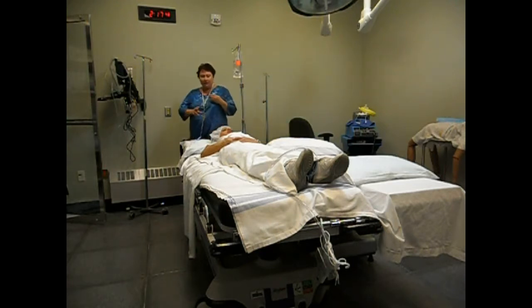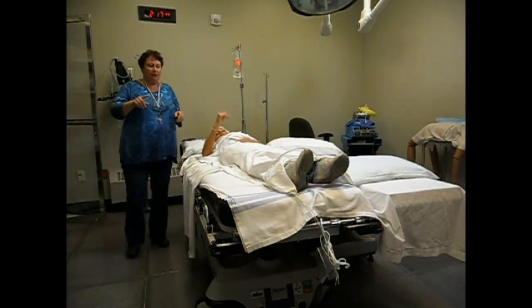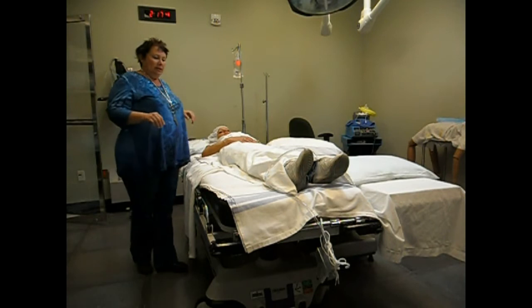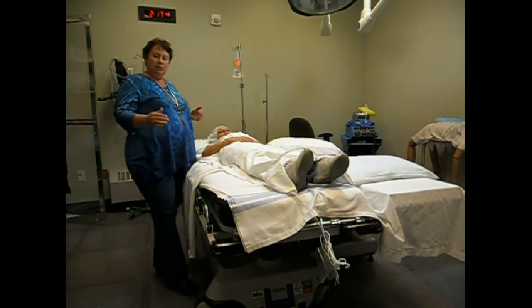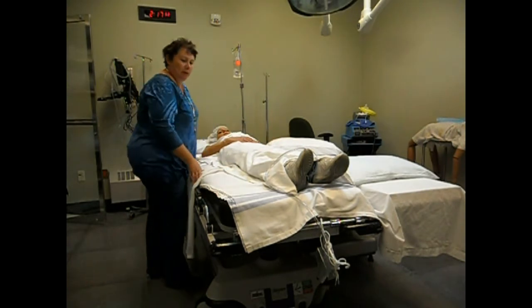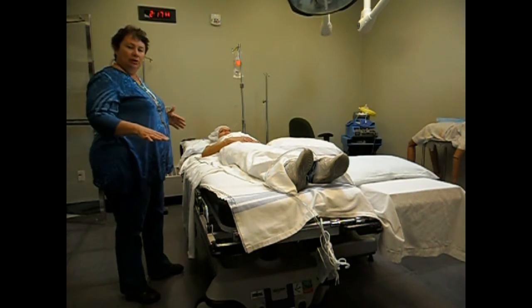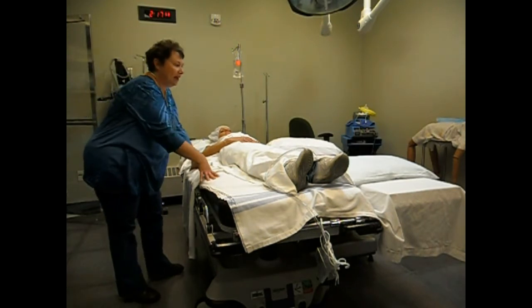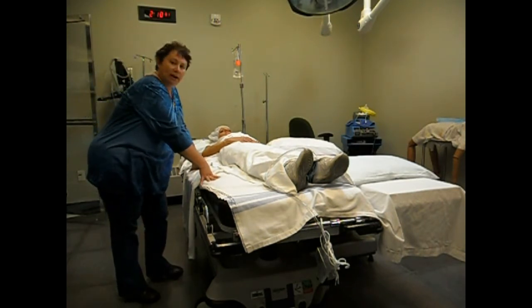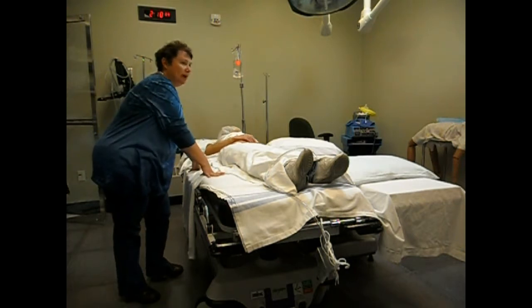Now, our patient today is going to have an IV in, and our patient has a Foley catheter in. The first thing we want to do is to bring our stretcher in and lower this side rail, butt up the bed so that they're pretty equal in height, and then put the lock on the stretcher, and we want the OR bed to also be locked. And so Fong's going to come over and check the OR bed.